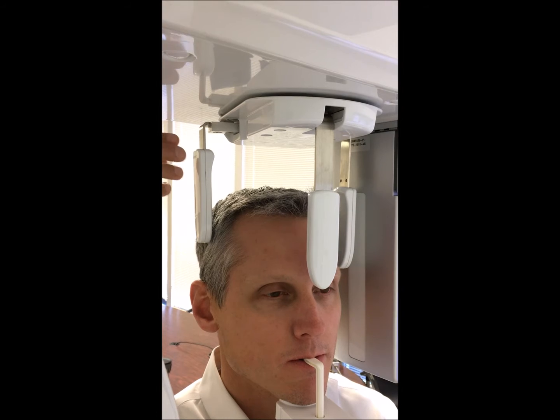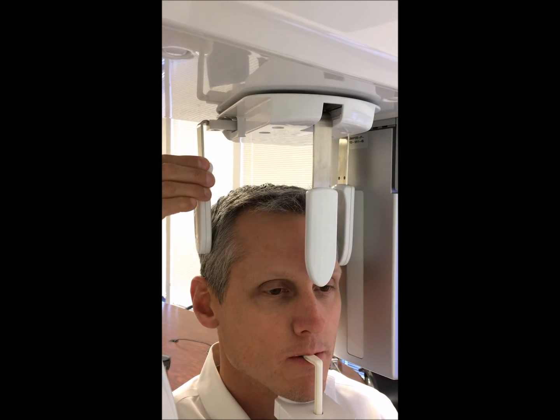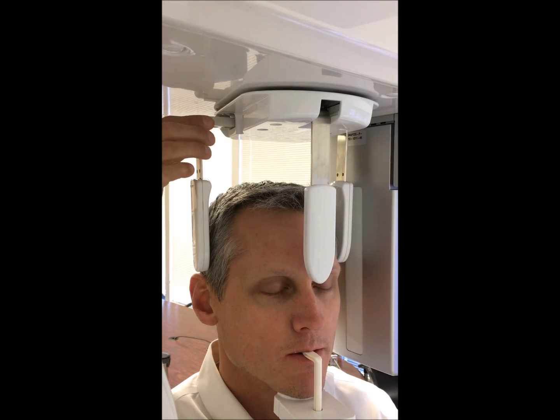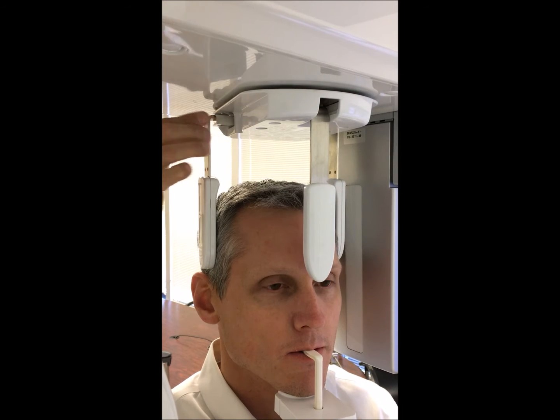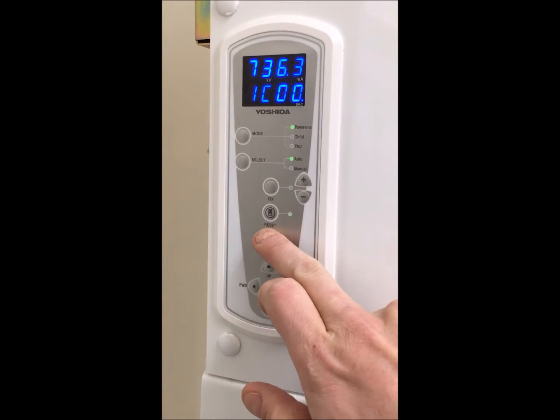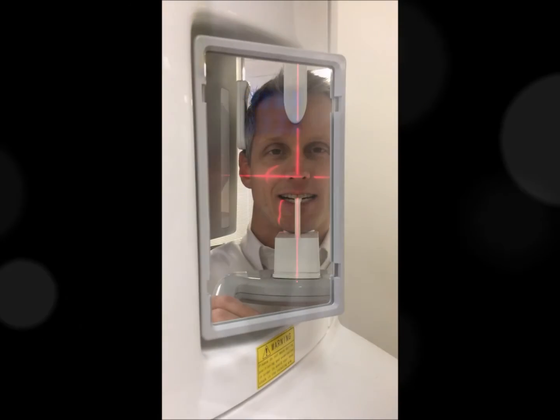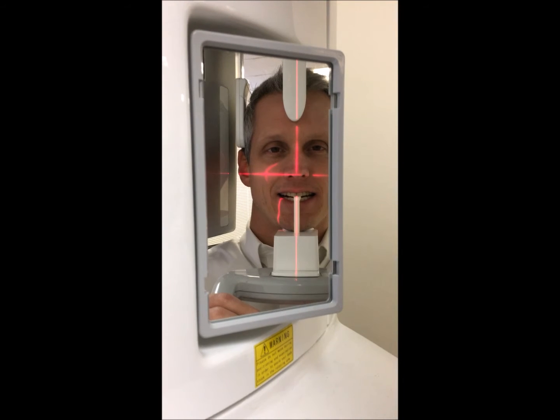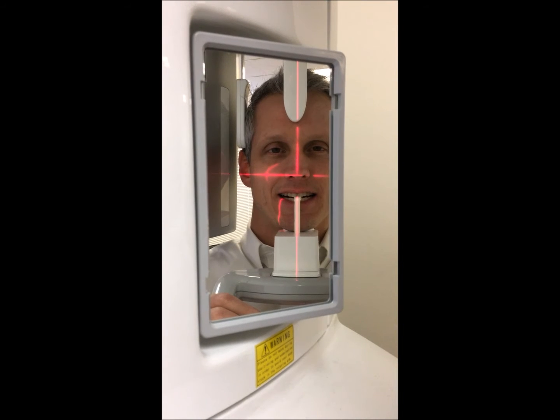Slide the headrest down and in to fit with the patient's head. Press the beam button on the control panel and the positioning lasers will turn on. There are three positioning lasers.